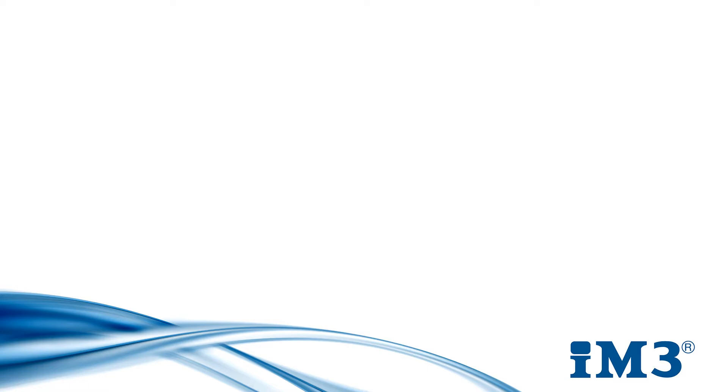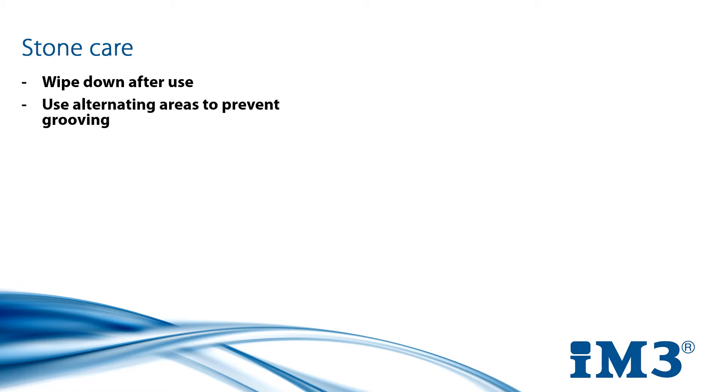If maintaining your instruments is important, so is maintaining the equipment you use to do it. Sharpening is done with a specially shaped and textured stone. To keep it working well, it is good practice to wipe it down after use to remove debris. Likewise, it is good practice to alternate the areas where you are sharpening, to prevent grooves and uneven surfaces developing which would sharpen instruments incorrectly.